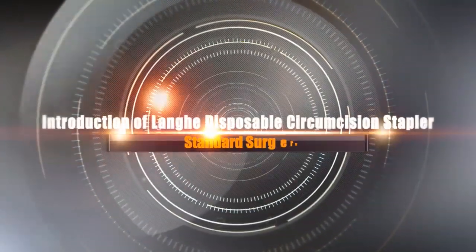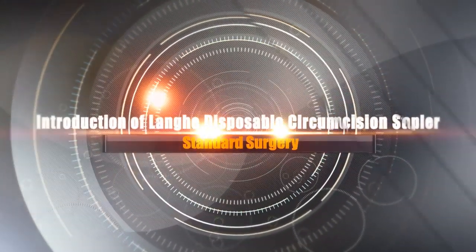Introduction of Langhe Disposable Circumcision Stapler and Standard Surgery.